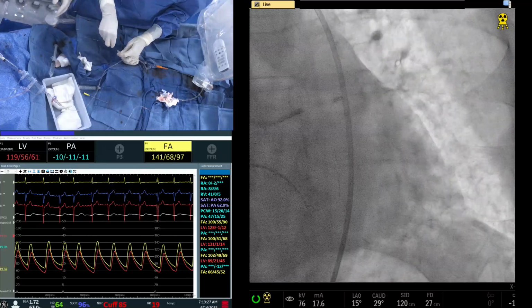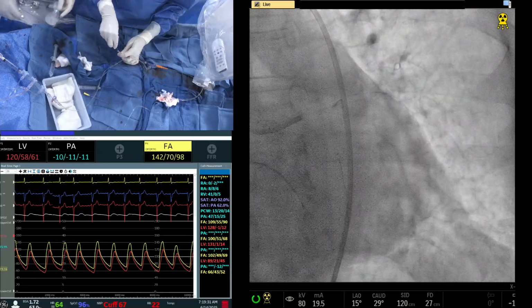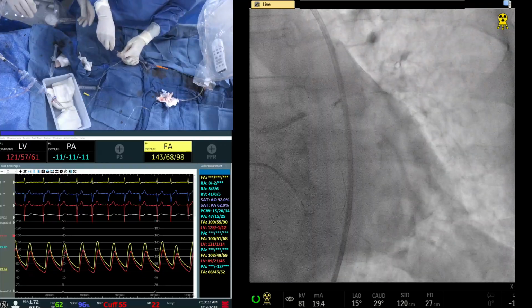Then what can you do? Coat the burr on both ends. So we did some data, some experiment, and we are making some changes. Good.